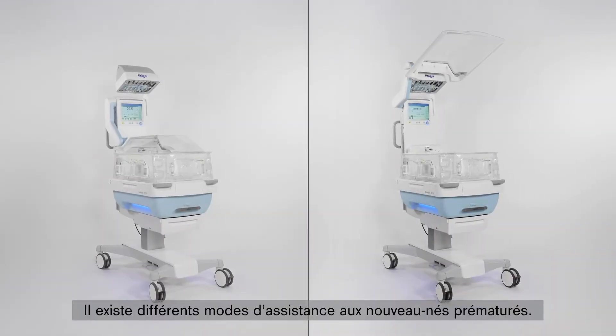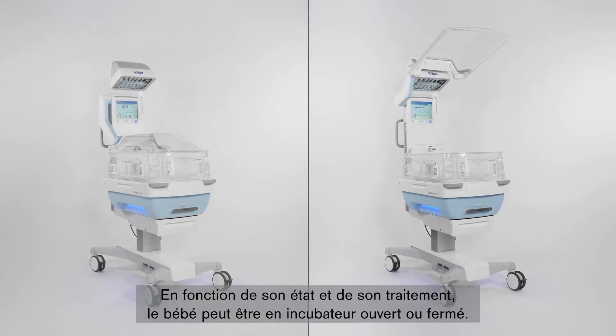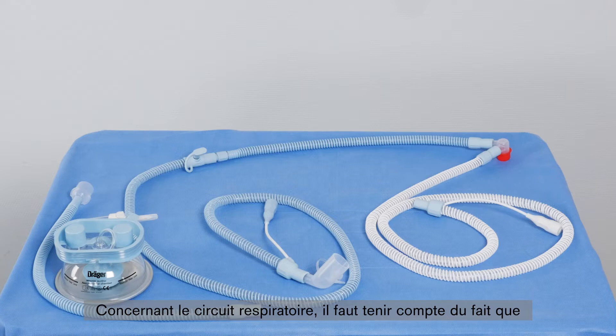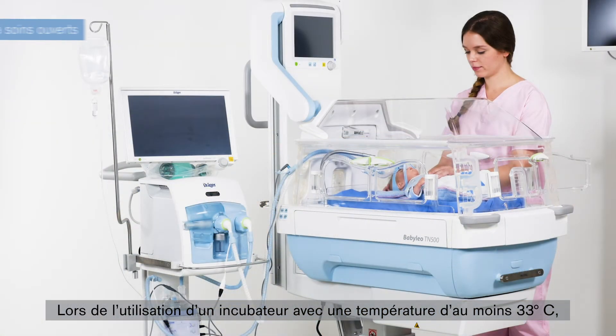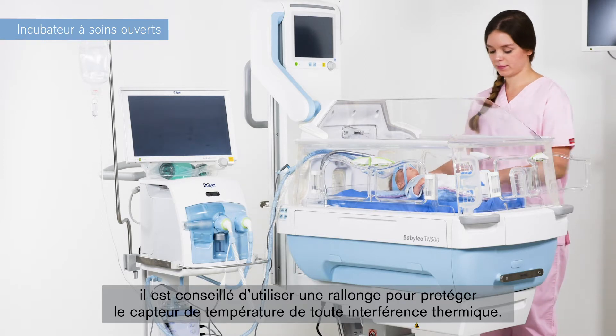There are several variants for the proper support of a premature infant. Depending on therapy and illness, the baby may lie in a closed or open nursing bed. Regarding the hose system, please note the following: the VentStar Heated Neonatal Plus breathing circuits have a common hose extension, to be found in the inspiratory limb between the sensor connector and the Y-piece, which is not heated. When using an incubator with a minimum temperature of 33 degrees Celsius, it is advisable to use an extension to protect the temperature sensor from thermal interference.